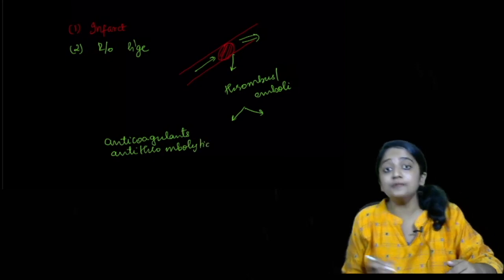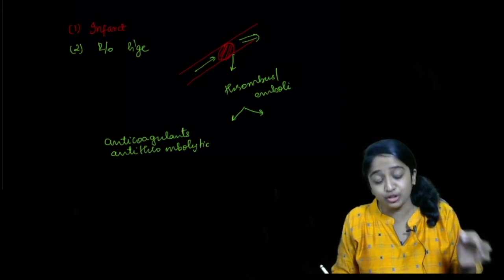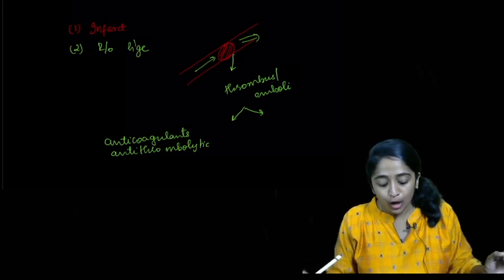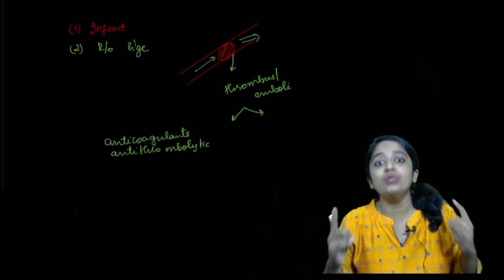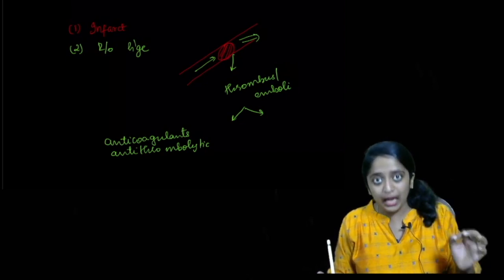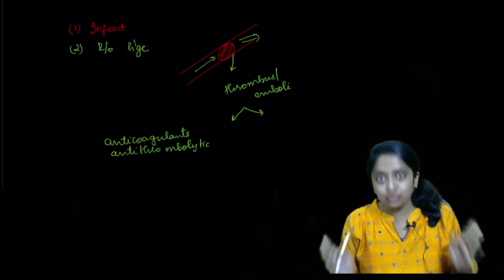If the cause of stroke is hemorrhage, which is a very small percentage, that is an intraparenchymal bleed, what happens when you give this treatment? You're going to do more damage than good. So always remember, our aim is to rule out hemorrhage in a suspected case of stroke.